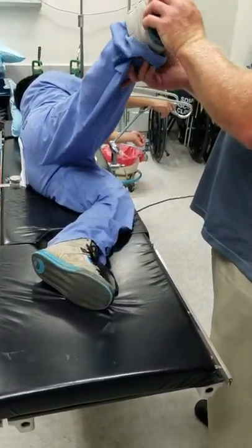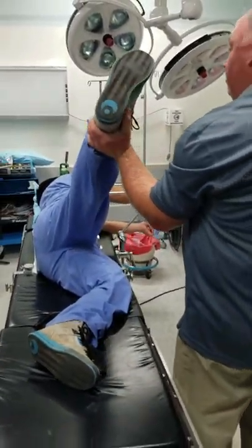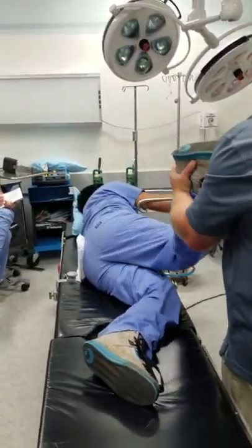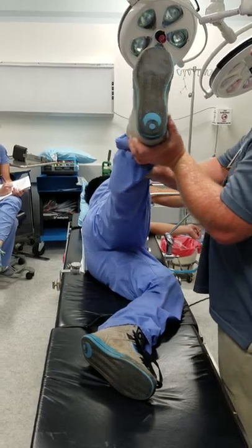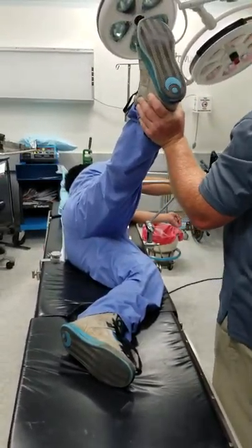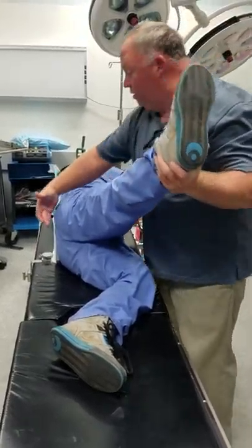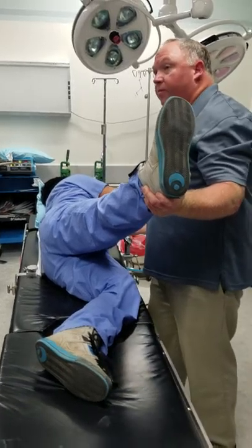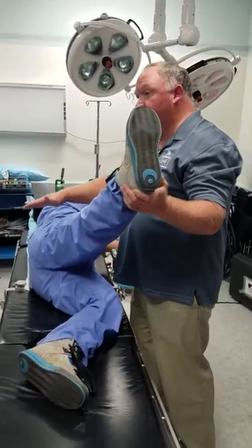When you put on the leg holder, you lift the leg up and externally rotate the leg — why? The external rotators are going to relax, and the hip capsule will be accessible. You hold the leg up in the air. Then we're going to put our drape at the groin, into the gluteal cleft, up toward the nipple. The nurse is going to prep everything.